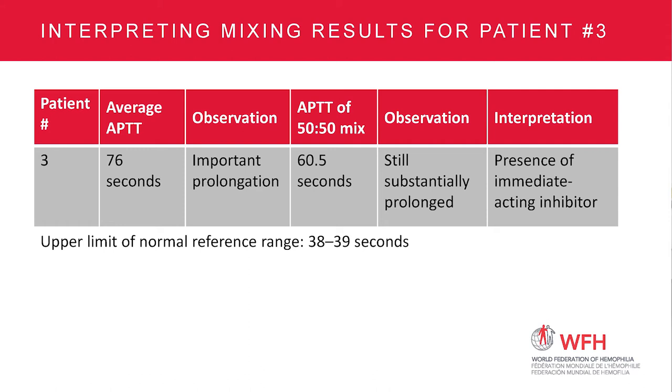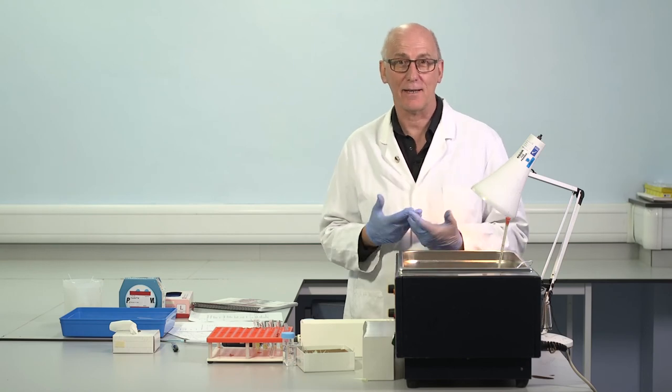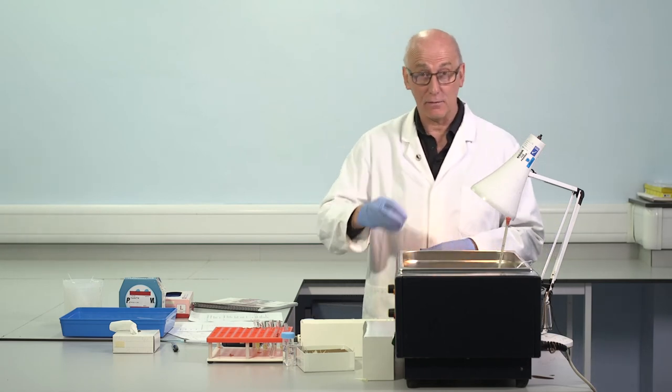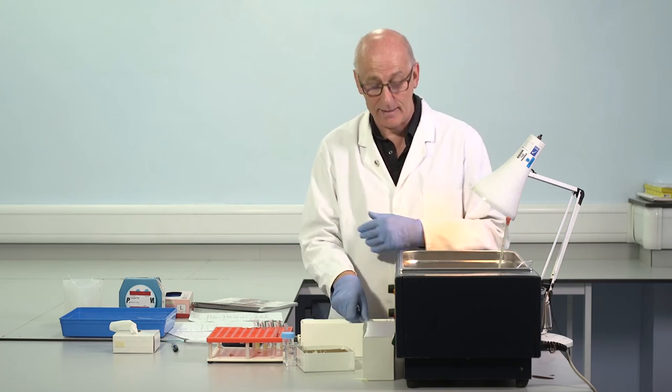Still grossly prolonged. Is it immediate acting? Well, it is, yes, because we made the mix, we did the test, gross prolongation. Remember, we've done some dilution, a 1-in-2 dilution, effectively, of wherever is the antibody concentration in the patient sample, diluted 1-in-2 in that mix. Nevertheless, it's still grossly prolonged. So for sure we have an inhibitor, an immediate acting inhibitor.